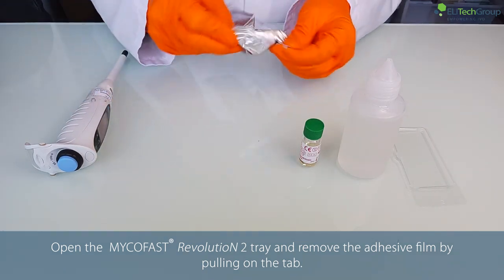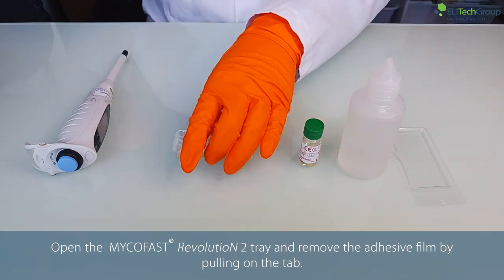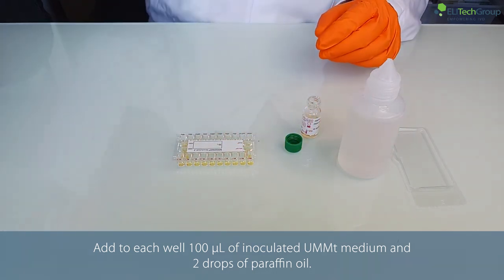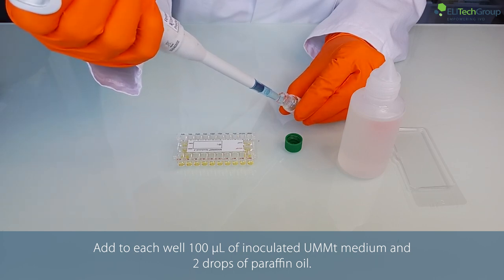Open the MycoFast Revolution 2 tray and remove the adhesive film by pulling on the tab. Add to each well 100 microlitres of inoculated UMMT medium and 2 drops of paraffin oil.